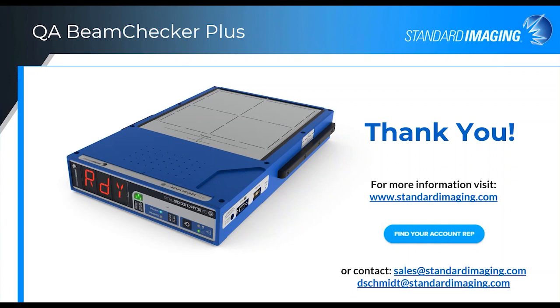The data, question about battery. Let me just answer this one with a battery question. The device will run off of the charger with the unit on for roughly 4 hours constantly. So we feel during your morning QA that should be fine. It's probably a fair bit longer than that, but I believe we specify 4 hours constantly while it's on.